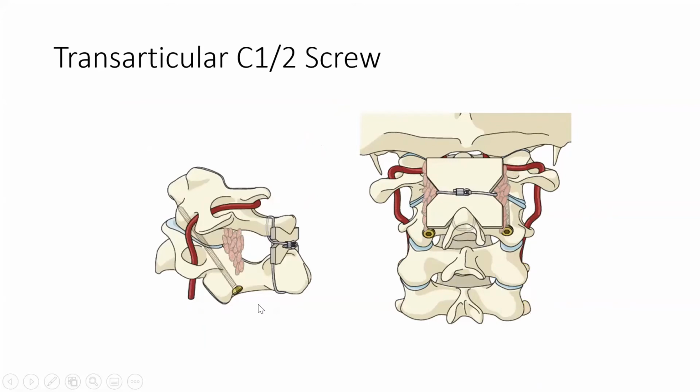From the lateral view, you can see it looks like that. In X-ray you normally see this big foramen transversarium, but you actually get medial to it, so it doesn't matter. Now, to do the C1, C2 screw, you have to have really reduced or aligned the C1, C2 joint. You can't use a screw to align the joint. So you've got to be able to reduce the fracture with position in the theatre, and once you've got it positioned, you then put your screw through it.